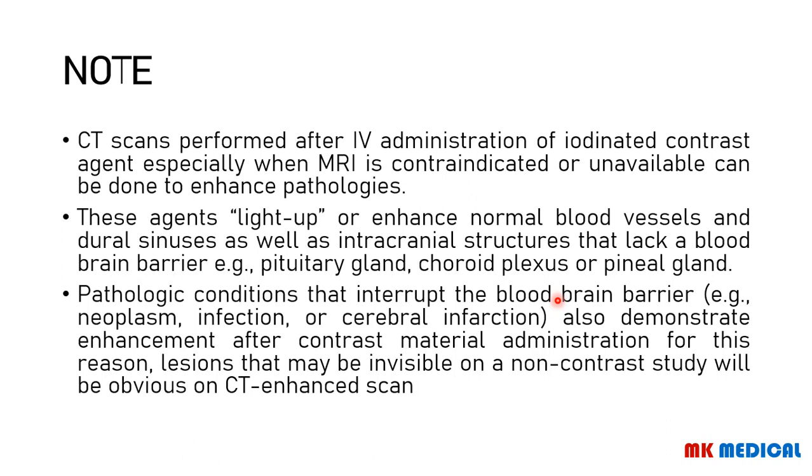The CT scan can sometimes be given with contrast, what we call contrasted CT scans, as opposed to plain CT scans. The contrast is administered intravenously. It's going to be an iodinated contrast. And this can be used especially when MRI is contraindicated or unavailable.